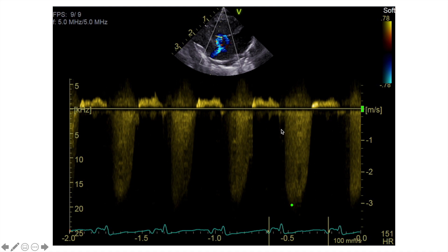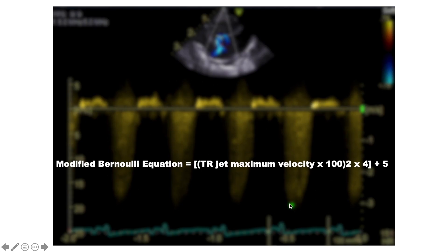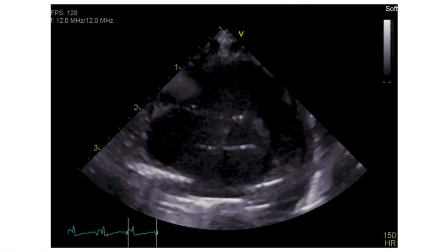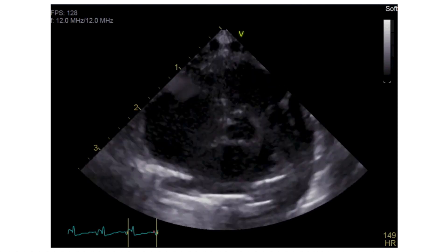This represents the flow Doppler pattern of the TR jet that we saw on the color image. We measure the peak velocity of the TR jet, and using the modified Bernoulli equation we come up with the RVSP. It's the maximum velocity of the TR jet in meters per second, squared, multiplied by 4, plus 5. The 5 here is usually the estimated right atrial pressure.